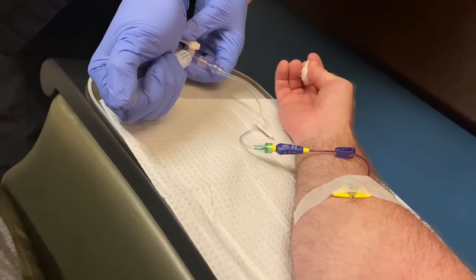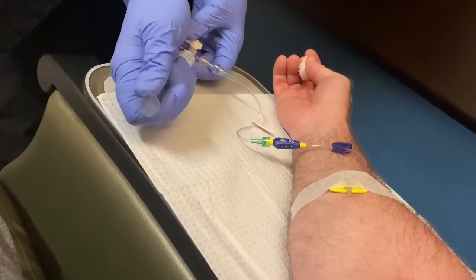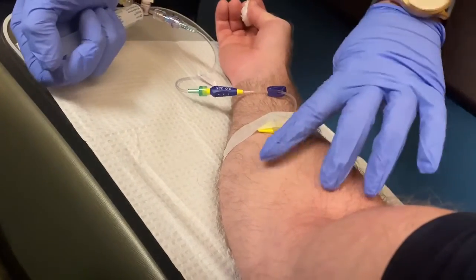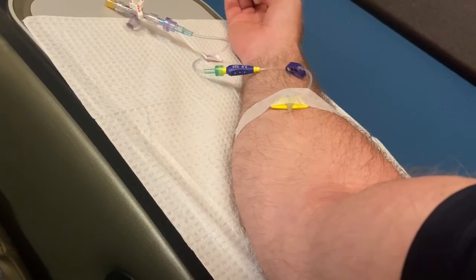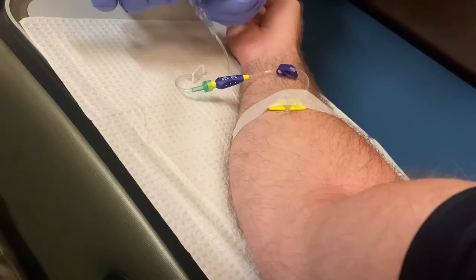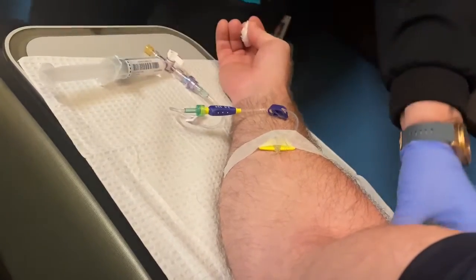Yeah, it's just going slow. That doesn't hurt, does it? No. These small needles have a hard time. Just a little bit of coldness. This is normal. Because it is radioactive, we don't want it just sitting here. That makes sense. We want to know exactly how much dose you're getting. All right, I'm going to go grab that and I'll be right back.